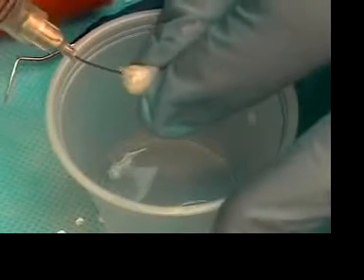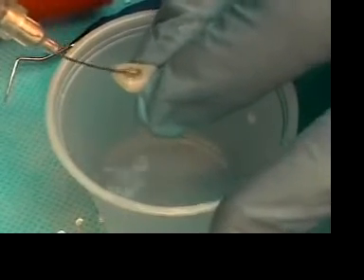So what I'm going to do is irrigate again for all the debris that comes out of there. The gates glidden creates quite a bit of debris. Check my patency.